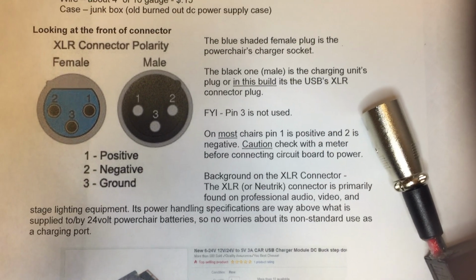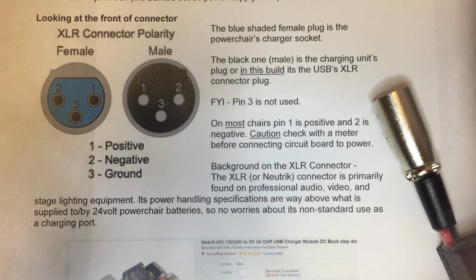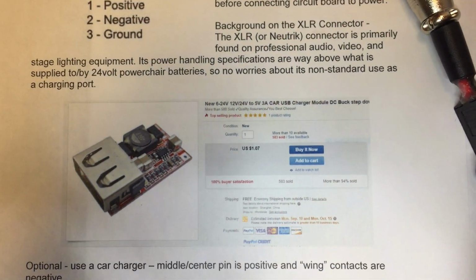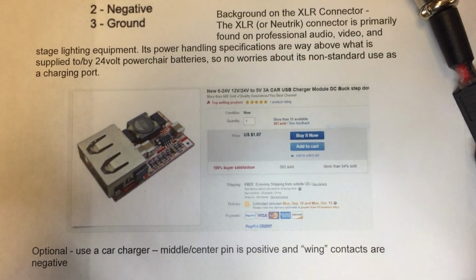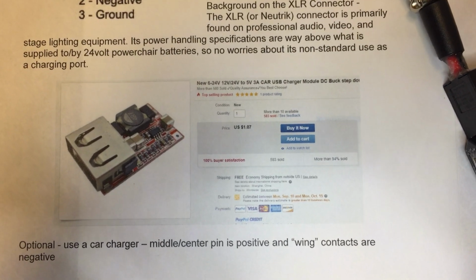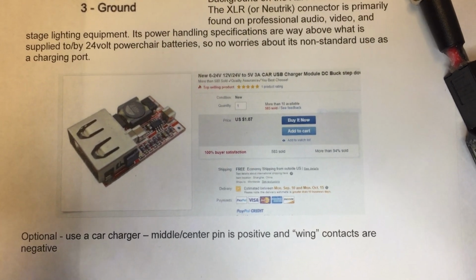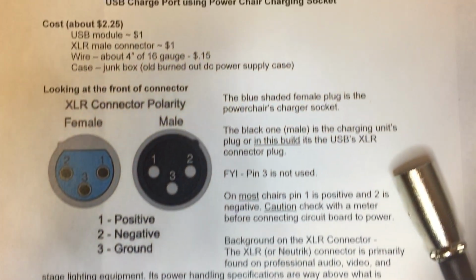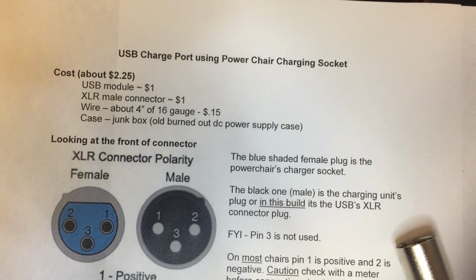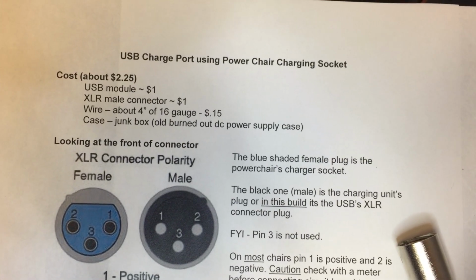The male is what you'll be using on the USB side, and then the female is what's on the power chair. As you can see, there are many of these things on eBay. The big thing here is to make sure that it can handle 24 volts and step it down to the 5-volt USB. And the parts list, again, it's real cheap. It's under $3, depending on what you find out there.